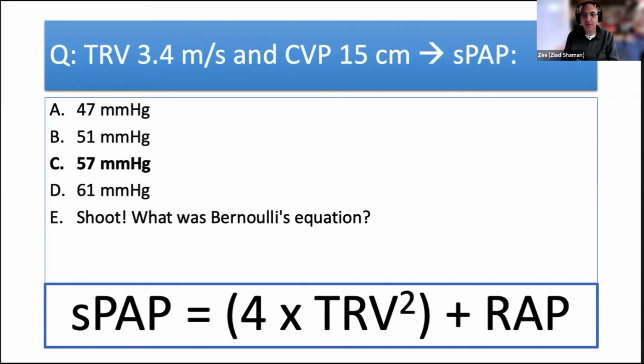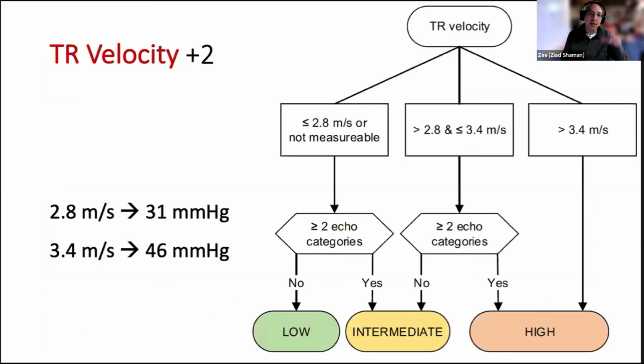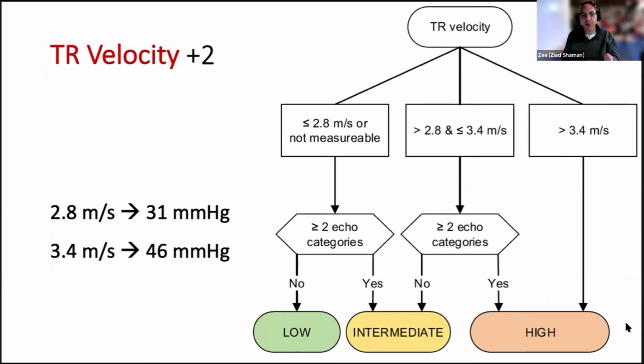Yeah, so instead of actually using the measurement itself of the pulmonary artery pressure, the Society of Echocardiography, British and European Society of Echocardiography, they say, don't do this, just use a predictor of whether you have pulmonary hypertension or you don't have pulmonary hypertension, and go after that and do a right heart cath, because that's what you're gonna use to decide on the therapy anyway.